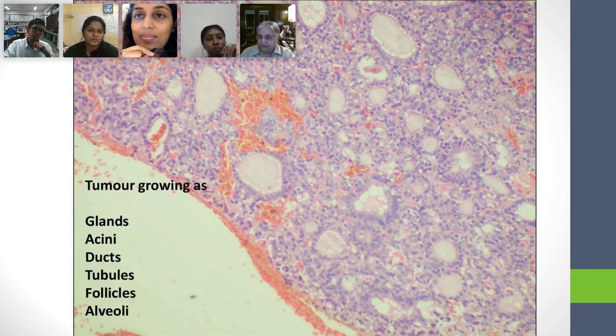Ma'am, follicles are more likely because they are all spherical. Okay. So you insist that it's follicles, and that's good. What about you, Neelam? They are all round. There's nothing that is not round. They're all circular, so probably I'll pick follicles. Very good. What about you, Neha? Ma'am, I'll go with follicles. We'll go with follicles. Excellent.